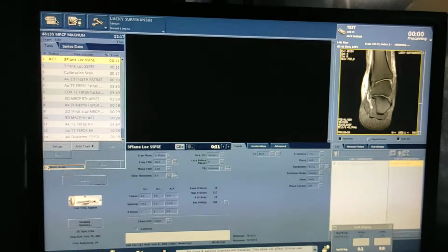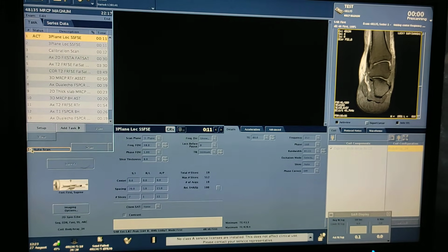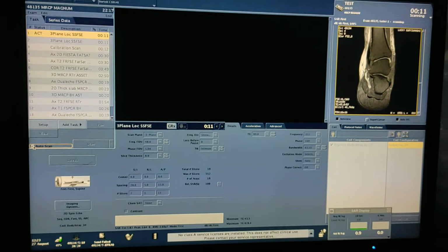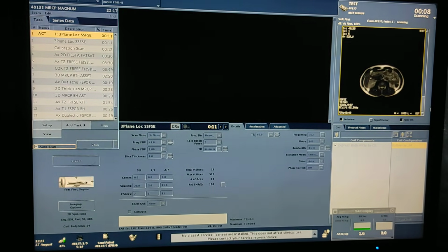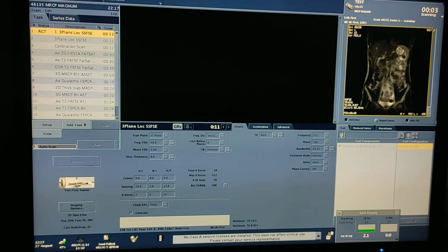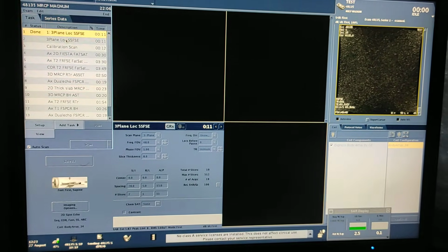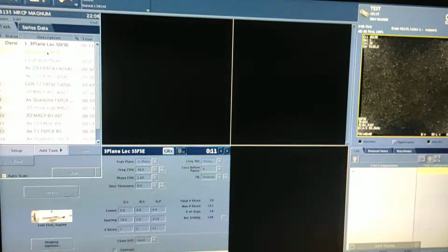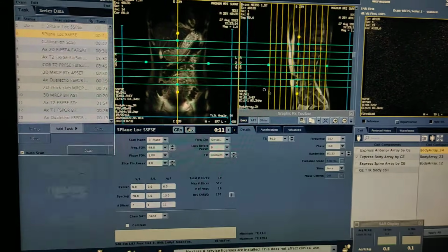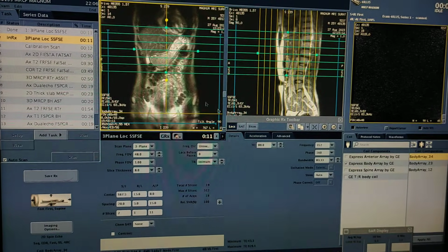In MRCP, we are diagnosing the CBD, pancreatic duct, gallbladder, and cystic duct. The patient should be NBM overnight for better resolution. Here I am just doing it for test purposes, so that's why the patient is not NBM. I will relocalize. You have to cover only this liver area.